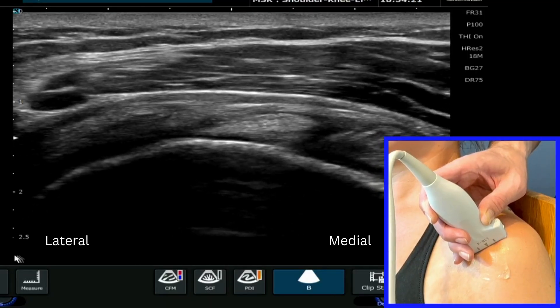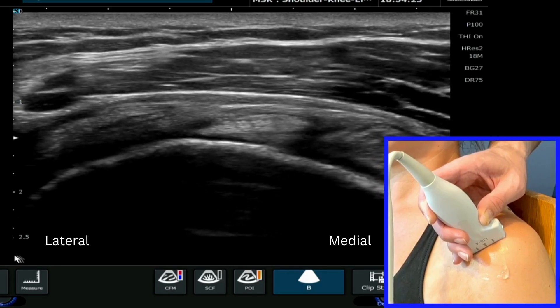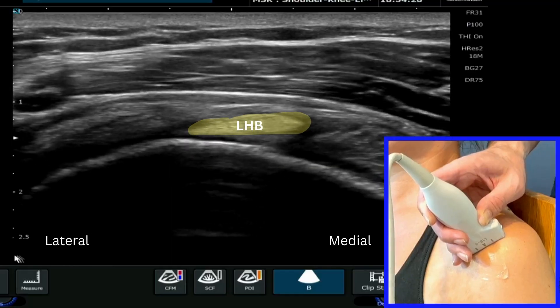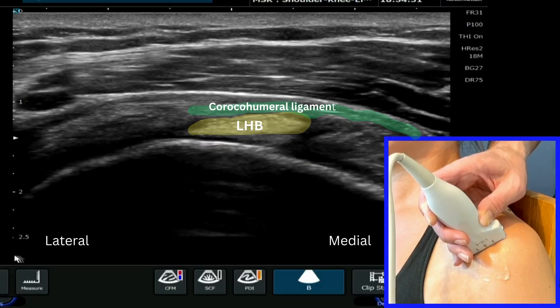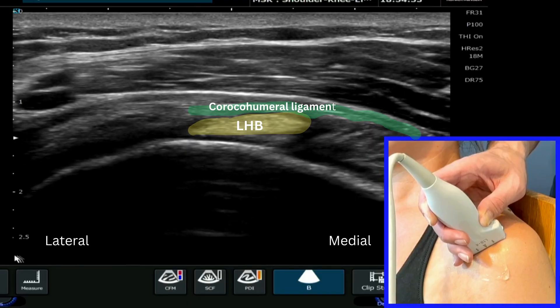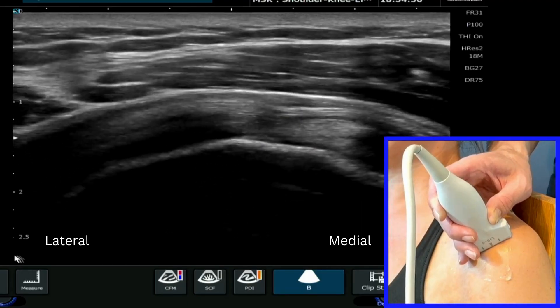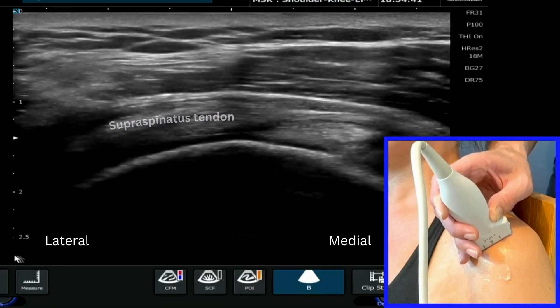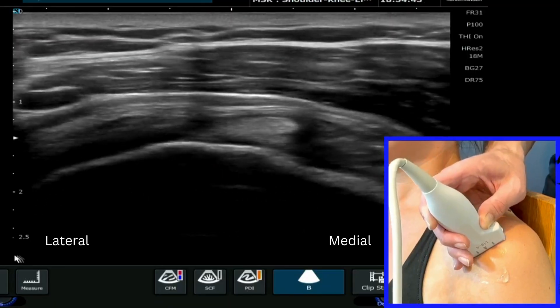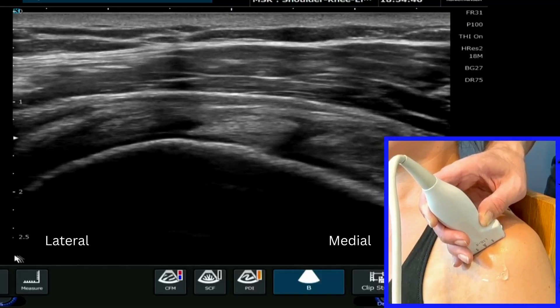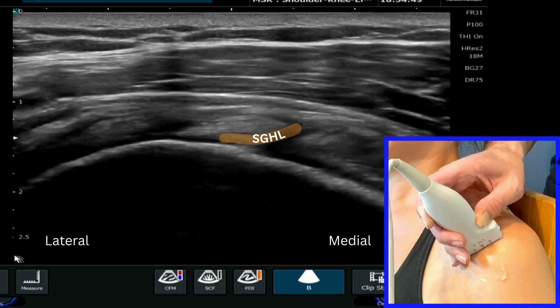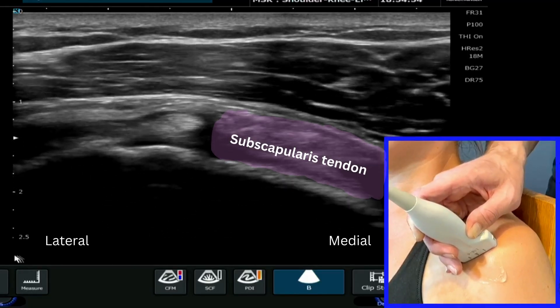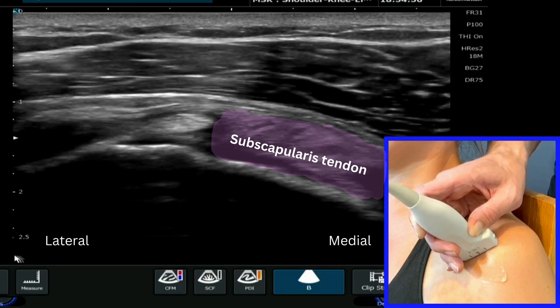Now what we can see in this image here is the long head of biceps tendon in the centre of the screen — the oval hyperechoic structure. We can see the coracohumeral ligament over the top of this, which then will merge laterally into the anterior fibers of the supraspinatus tendon. We can see some of the fibers underneath the biceps tendon of the superior glenohumeral ligament, and then as we come that little bit more medial we'll see the fibers of subscapularis coming through.